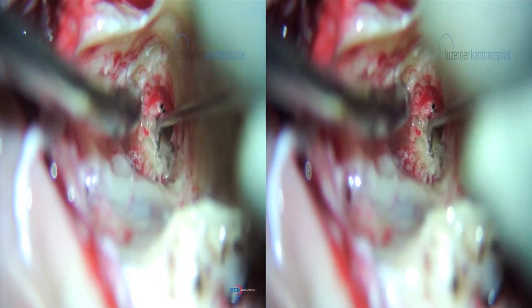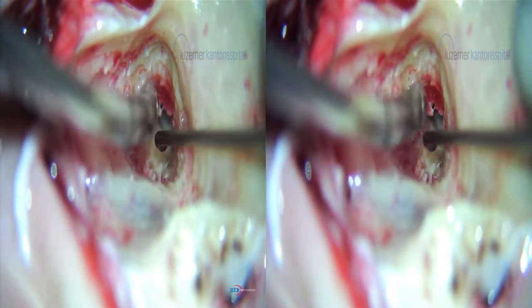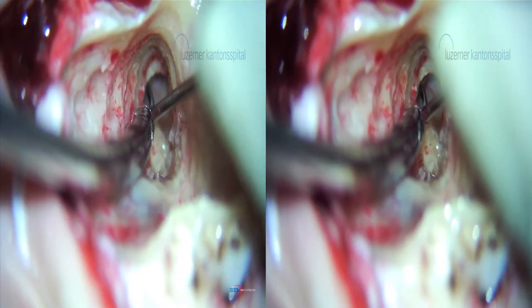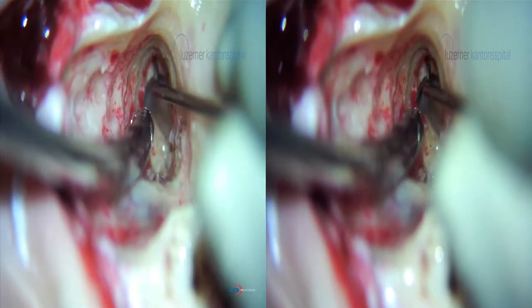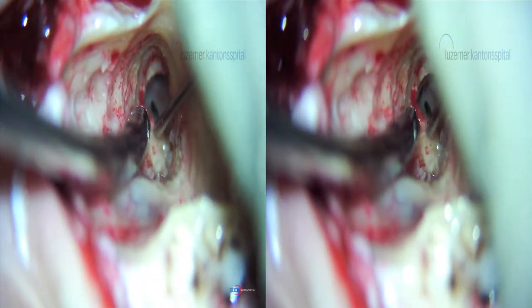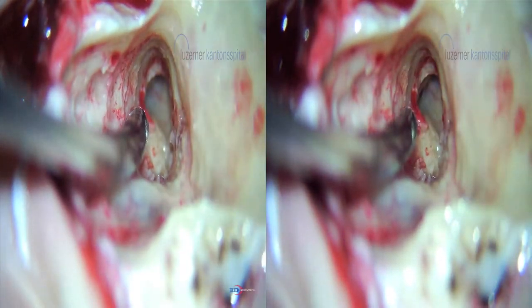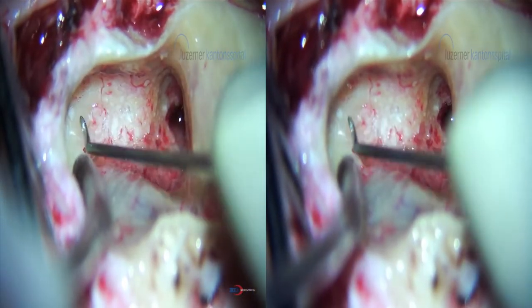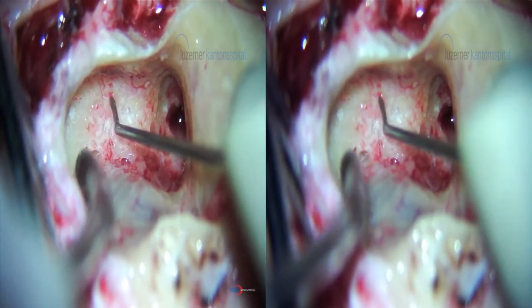The incus is identified. The antrum is opened and the incus and malleus anteriorly are seen, as well as the lateral canal.